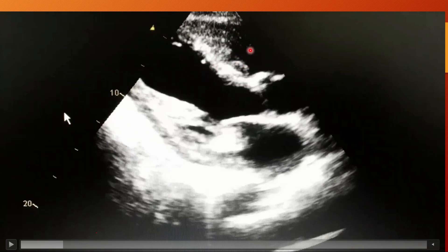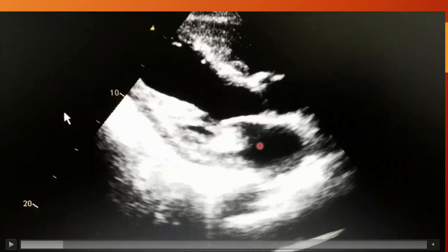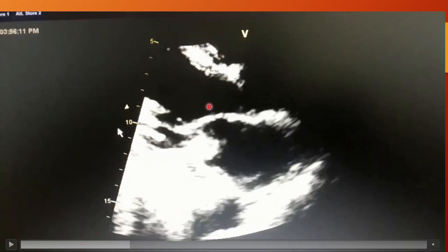In the parasternal long axis view you can see the right ventricular outflow tract, then there is the left ventricle. Between these two there is the interventricular septum — that is the anterior part of the interventricular septum — and there is the inferior wall of the LV. This is the left atrium, and this is the root of the aorta with the aortic valve between the LV and aorta.